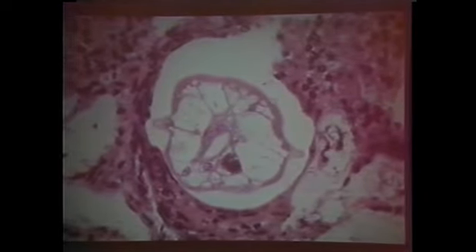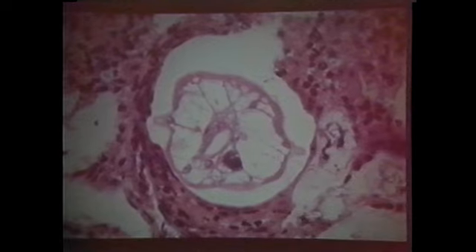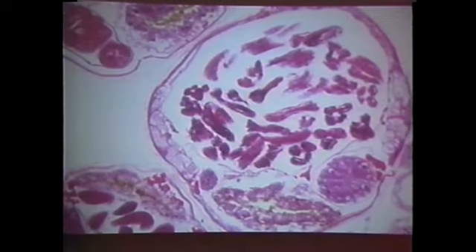Now, let us go through the groups of nematodes. All right? This group is the atrachids, which are first cousins to strongyloides. Excuse me, they're kind of pinworm-like things. And I have this all in your handout, but there's lateral alae. The musculature looks a little platymyarian, kind of hard to tell. But look, you can see there are larvae inside of this worm. Okay? Sometimes muscle is so inapparent you can't tell.